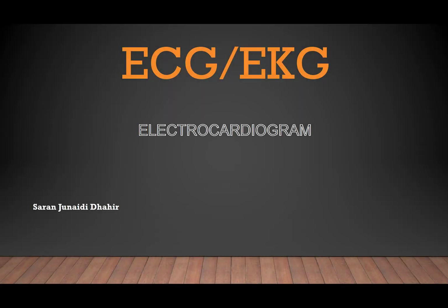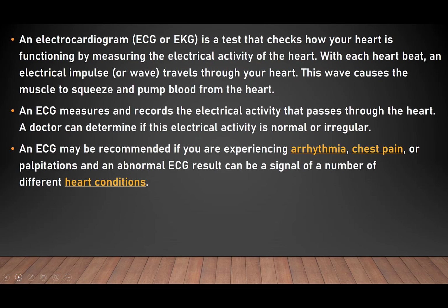Today I'm gonna talk about the ECG or EKG, the electrocardiogram. Okay, so let's start. Here we have the definition: the ECG is a test that checks how your heart is functioning by measuring the electrical activity of the heart. As you know, the ECG is an important diagnostic tool that we use especially in the emergency department, and it's important for being able to look for arrhythmias, myocardial infarction, or other problems of the heart.